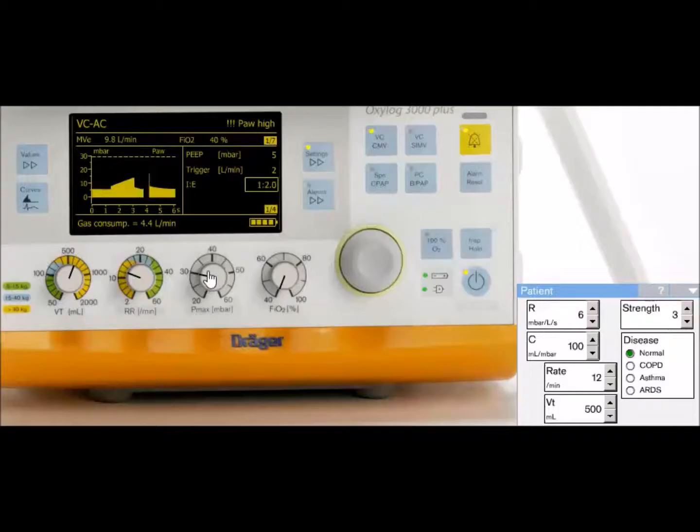And it's not automatic or anything. It's still based on operator input. So that's why it's a little off the paper, where the paper is more about whether the mode of ventilation automatically does this, without needing a practitioner at the bedside. But this showcases why we still need respiratory therapists and people at the bedside to see these asynchronies, recognize them, and actually change these inputs or values.